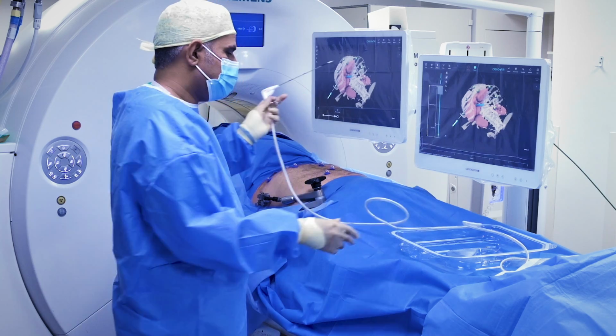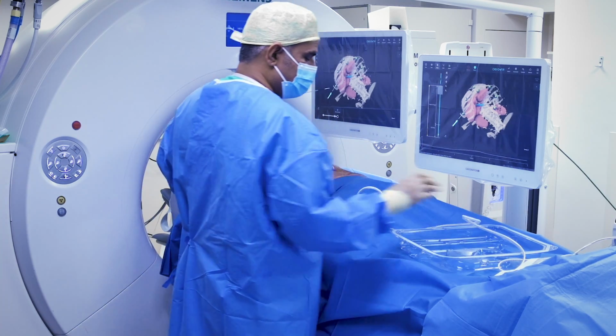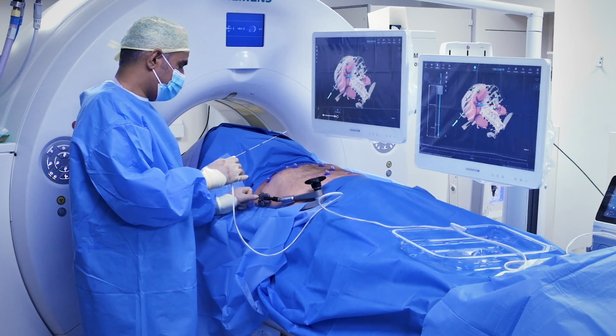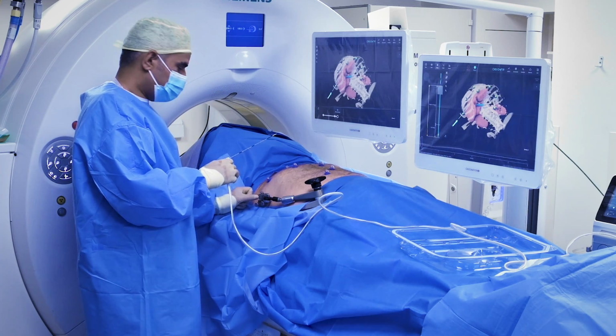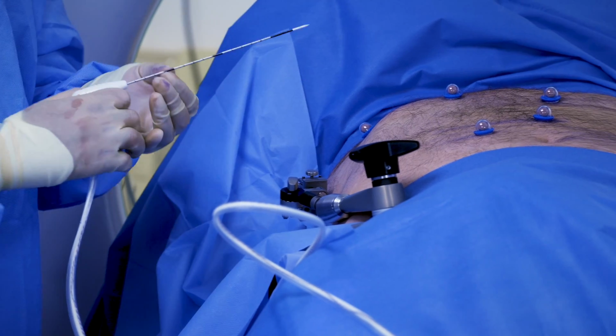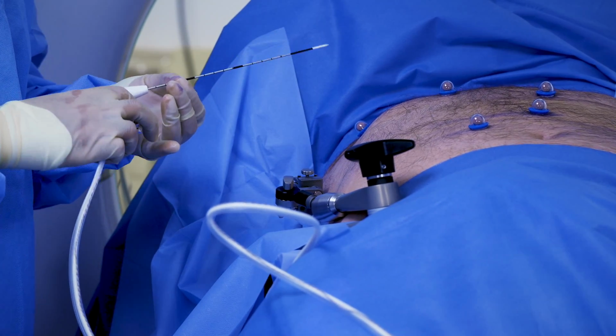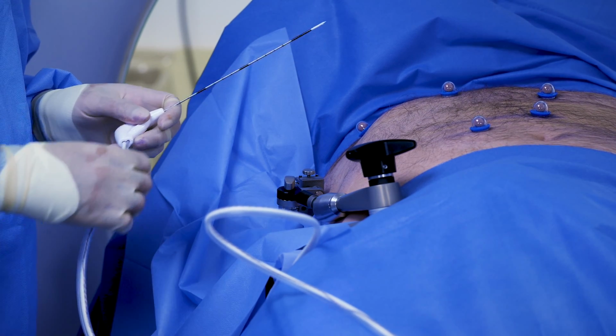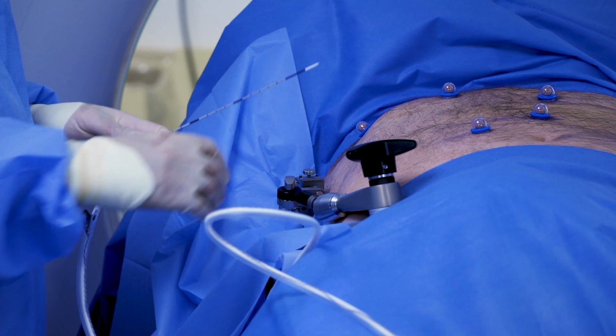That's good. So we're now ready to position the probe, to put the actual probe in. We know it's 16.7 centimeters. That will be from this surface here, which is where we've measured with the aiming device. And we know we have the markers on the antenna to tell us how far to go in. So 16.7 is there. We'll be putting this in on a breath hold.